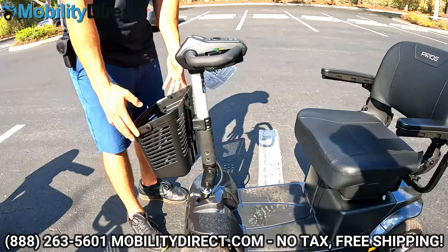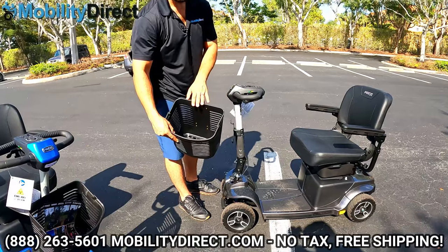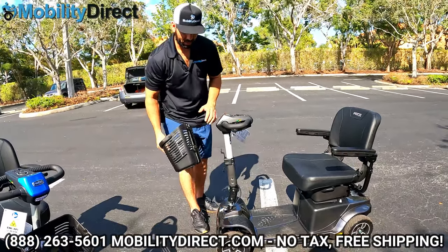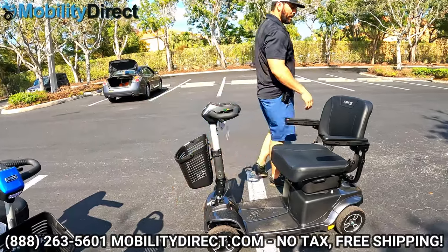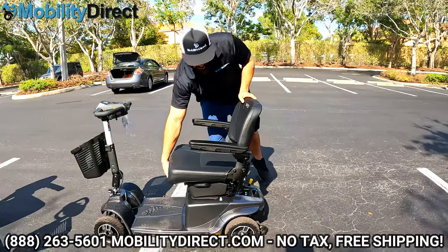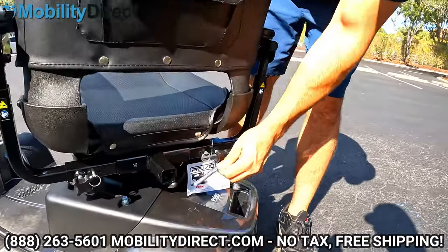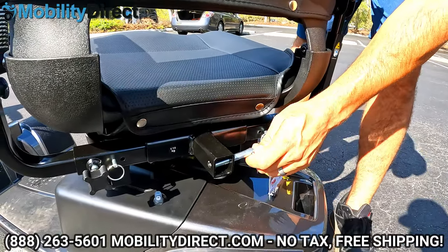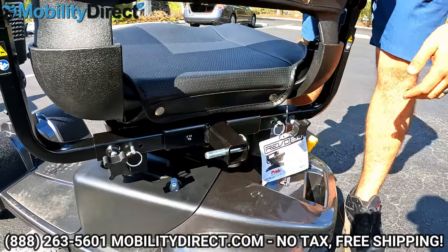It comes with an extra-large front basket — a big one where you can fit a lot of groceries. It just hooks on with two rails. On the back, there is a one-inch square hitch receiver for universal accessories. You can put an extra-large cage-style shopping basket, an oxygen tank holder, walker holder, or cane holder — tons of universal accessories work with that.